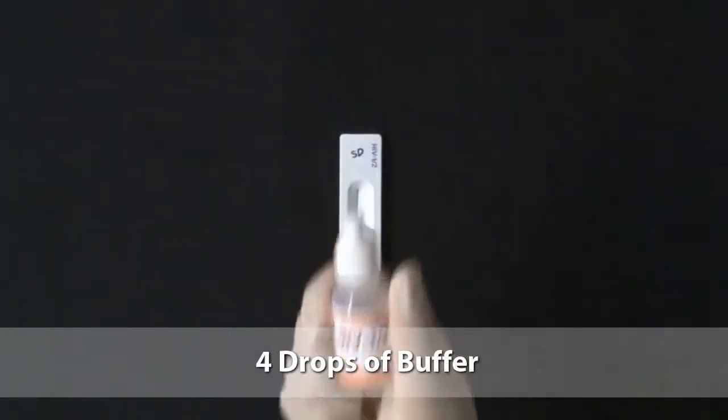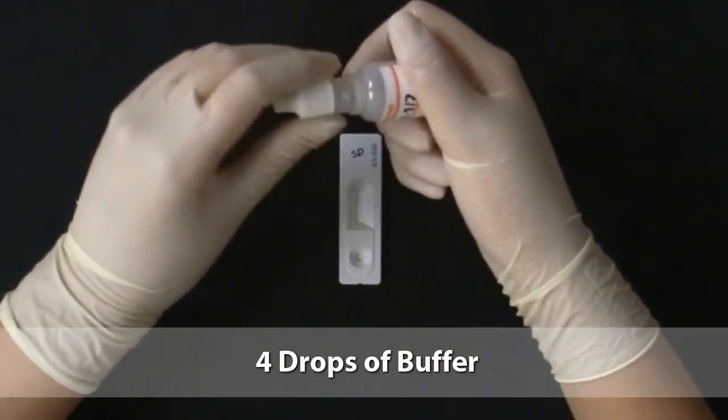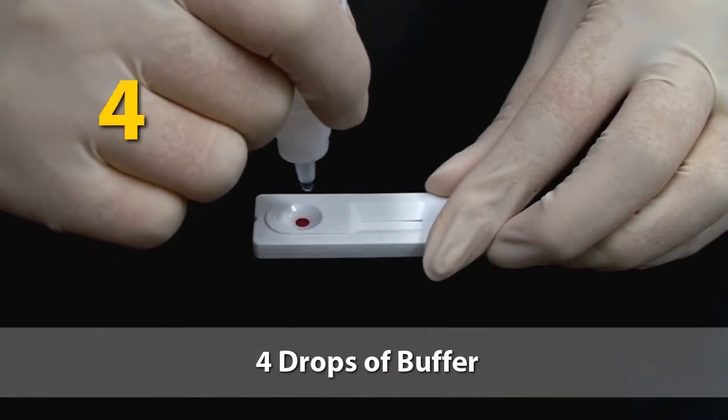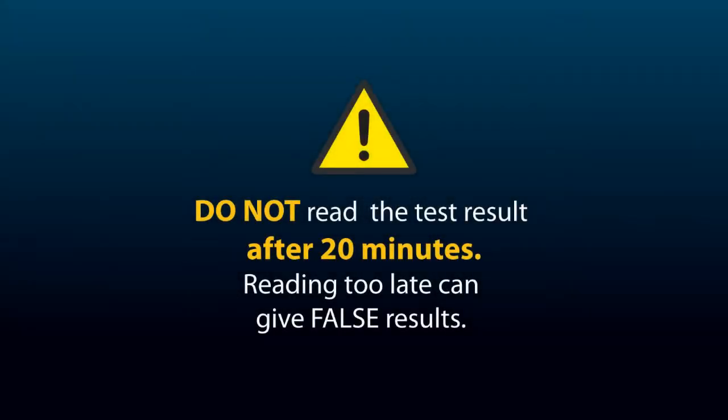Add 4 drops of buffer into the same round well. One, 2, 3, 4. Read the result in 20 minutes. Remember, do not read the test results after 20 minutes. Reading too late can give false results.